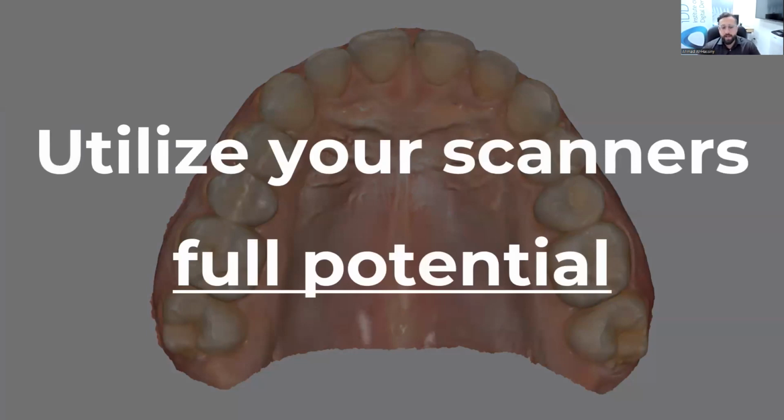And this is part of the other thing about ROI, is that you need to utilize your scanners to their full potential. A scanner these days is not just a digital impression tool. It's not just a tool to replace impression material. It's so much more than that. It's such a powerful communication tool. And there's so much wow factor involved when you show your patients this.